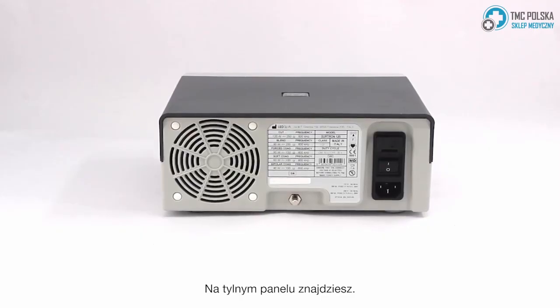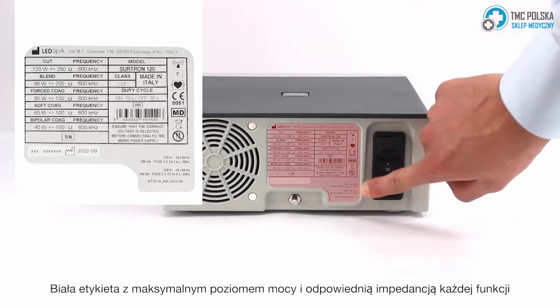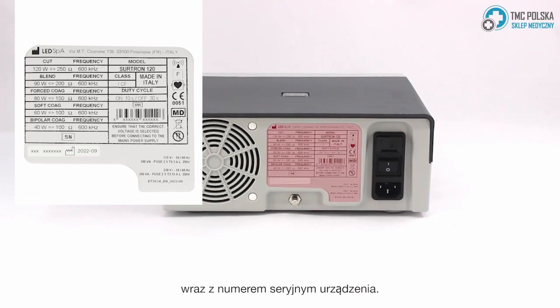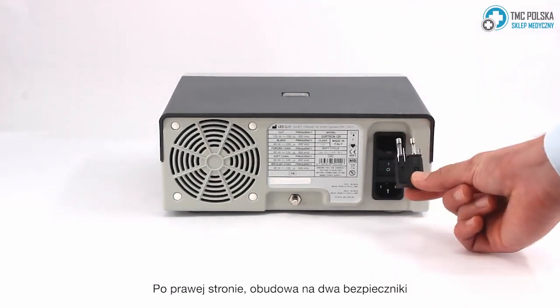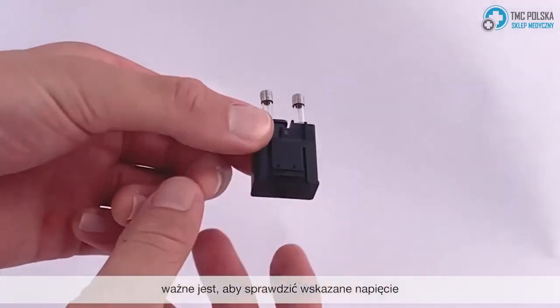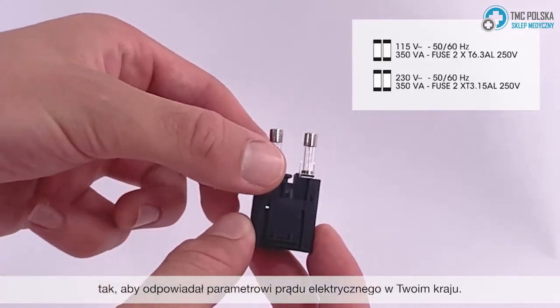On the back panel you'll find the white label with the max power level and corresponding impedance of each function, along with the serial number of your device. To the right is the housing for two fuses. It is important to check that the indicated voltage is set to match the electrical current in your country.